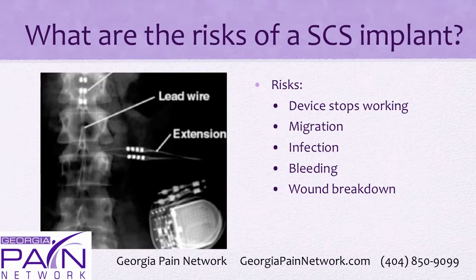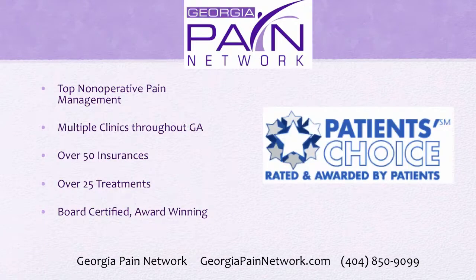What are the risks? Well, one risk is that the device will stop working. Another is there's an incidence of migration of the leads, maybe infection, bleeding, or a wound breakdown.